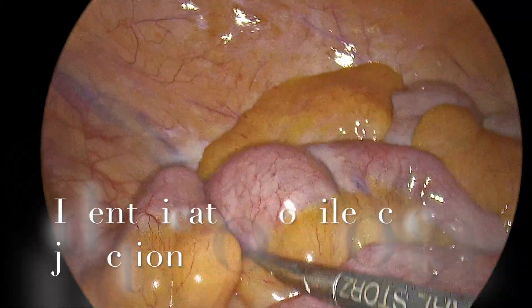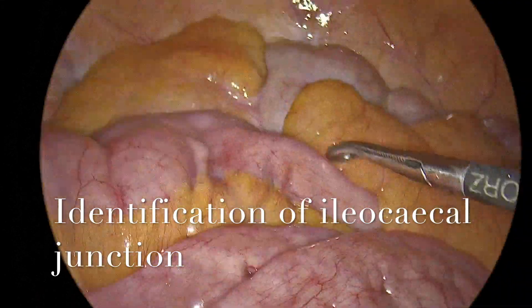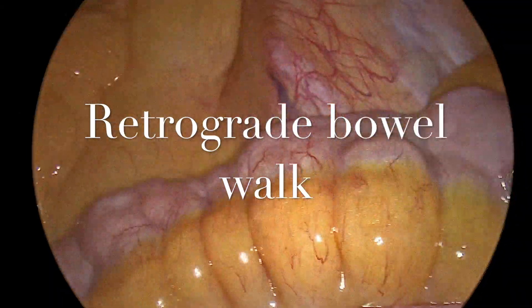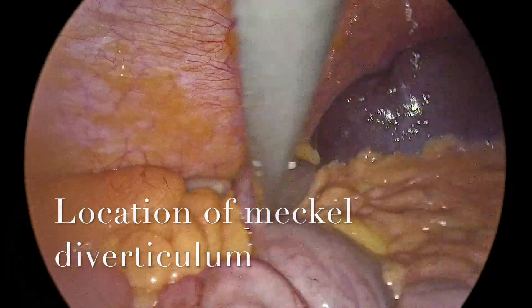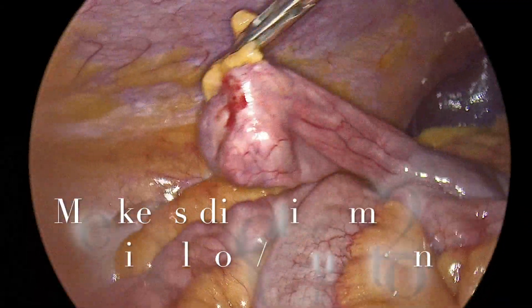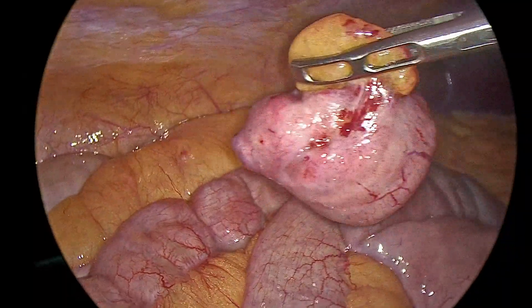We will start with exploratory or diagnostic laparoscopy. We put in the working ports and camera port, and then the first thing we do is localize the ileocecal junction. From there, we start a bowel walk using an atraumatic clamp, going retrograde — in reverse — walking towards the ileum. In the mid or distal ileum, approximately 2 feet proximal to the ileocecal junction, we could find this diverticulum.